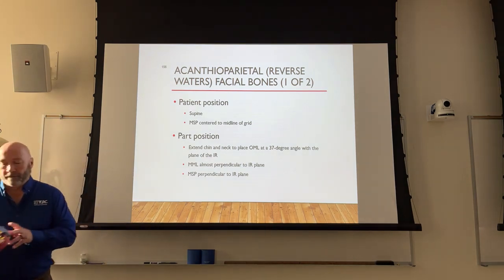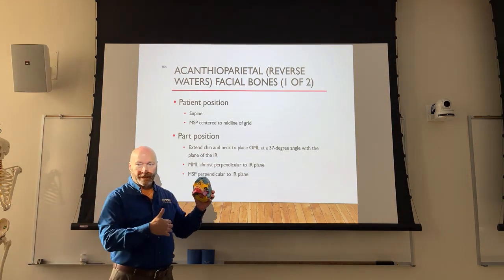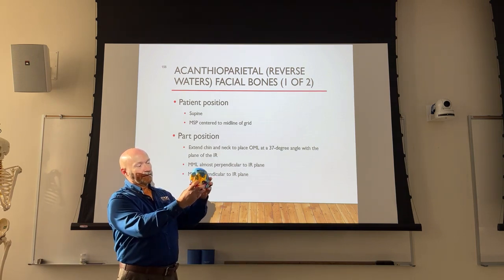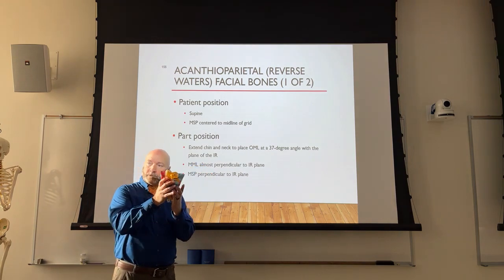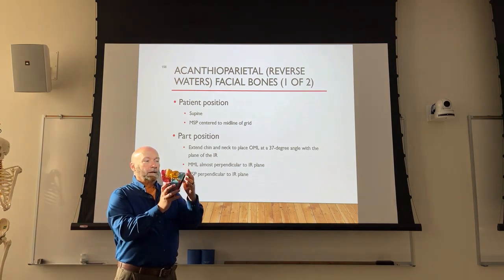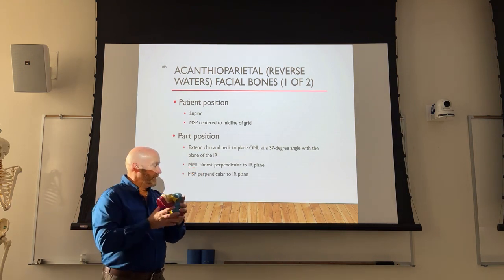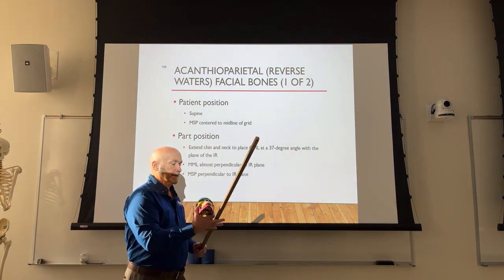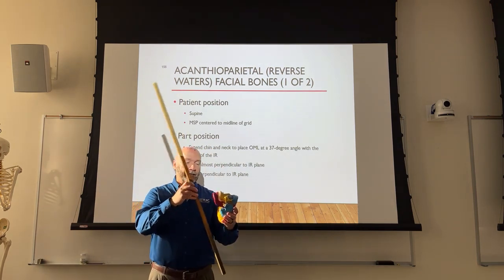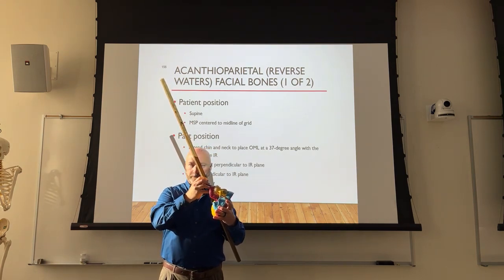So if you can move the patient's head, if they've cleared them out of the collar but they're still on a backboard and you have to shoot them AP as opposed to PA, then you just do the same thing. For 55 waters, you would extend the chin until the acanthomeatal midline is perpendicular to the backboard or the table, right? It's vertical. And for the 37 waters, you put the mentomeatal line vertical. But if they're on a backboard, they're probably going to be pretty well positioned for 55, but for the 37, what you would do is angle your central ray until it parallels the mentomeatal line.